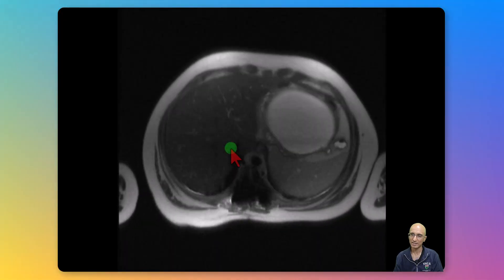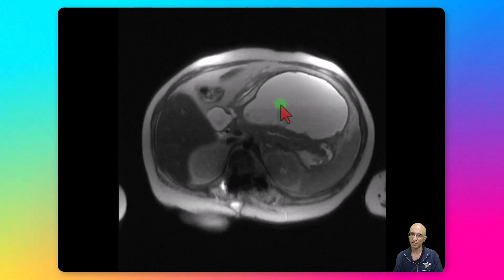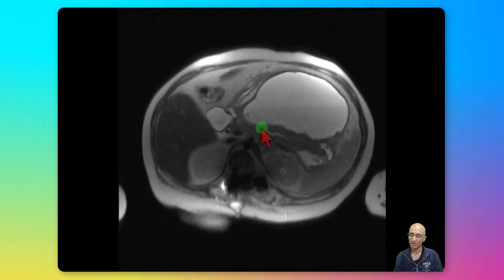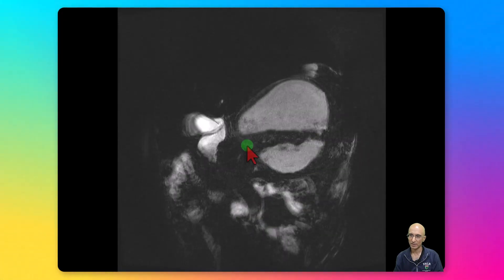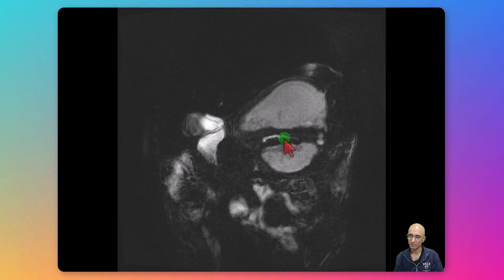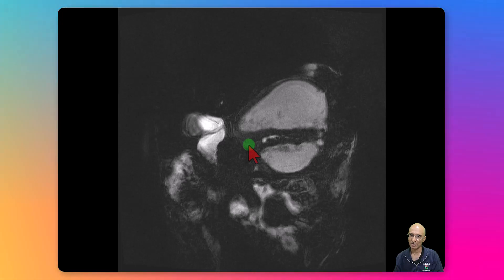On the MRCP axial T2 HASTE images we can see the large pancreatic pseudocyst causing mass effect on the stomach. We can see the pancreatic duct in the region of the distal body and tail which abruptly tapers, with no obvious communication between the pancreatic duct and the cyst. On the MRCP images, the slightly irregular pancreatic duct in the region of the distal body and tail is again noted to abruptly taper, with no communication to the cyst.